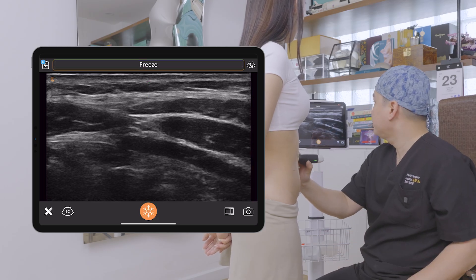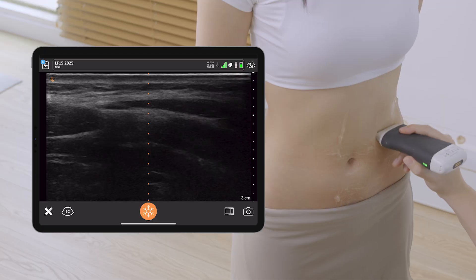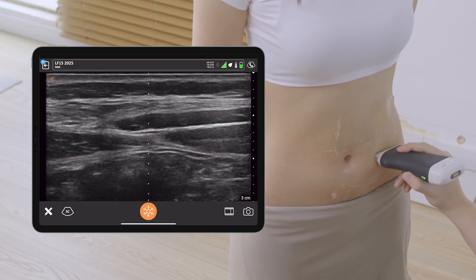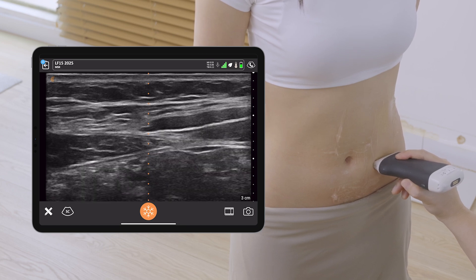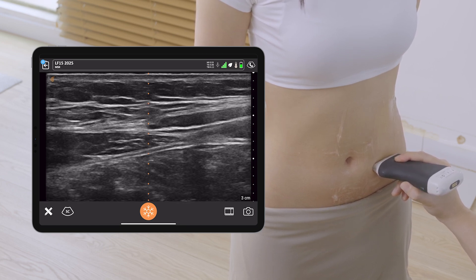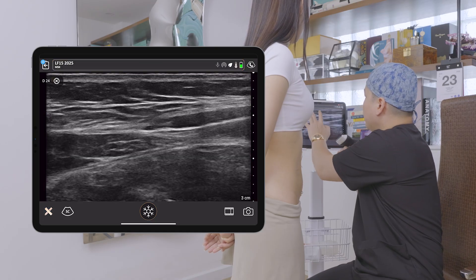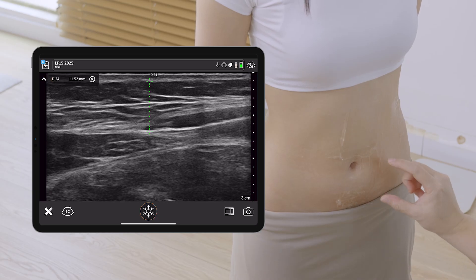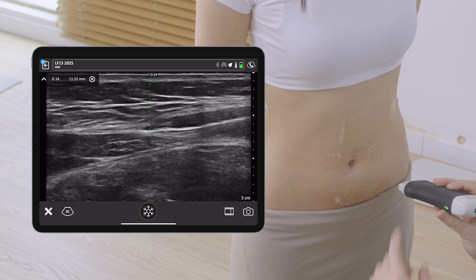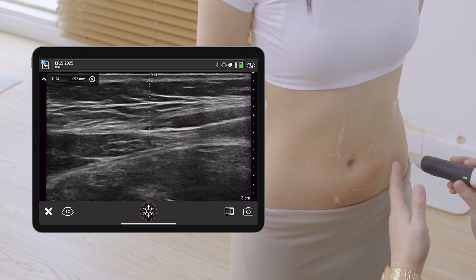As I go down the abdomen, the subcutaneous tissues above the linea semilunaris thicken — just now it was 5mm and now it has become almost double at 11mm. Because of the thicker subcutaneous tissue in the lower abdomen, her linea semilunaris is not apparent there.